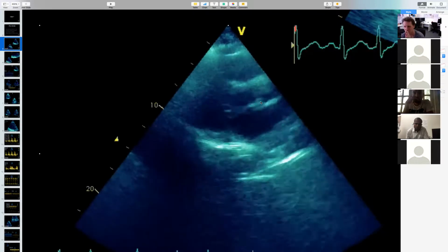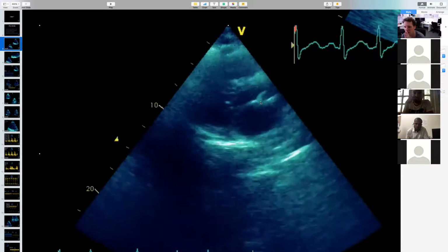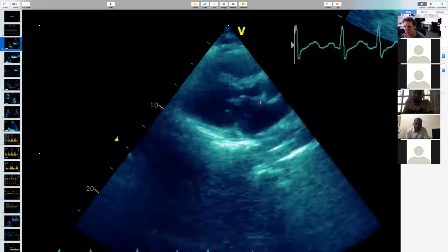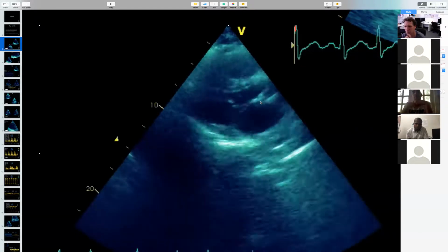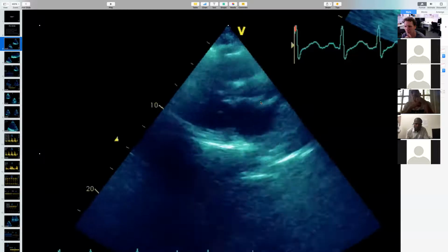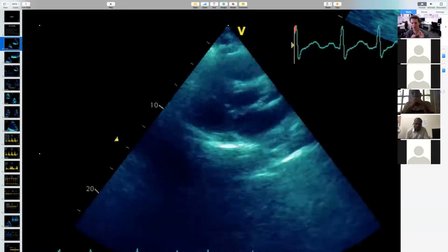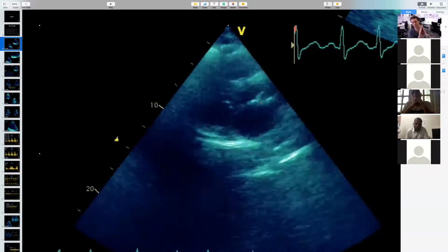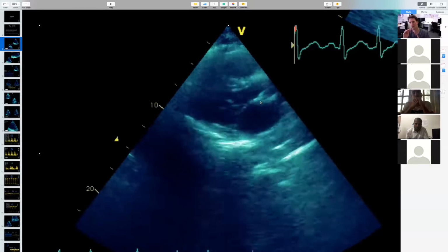Yeah. So anatomy and morphology of the valve. Nice. Valvular and subvalvular thickening, chordae thickening, doming of the anterior mitral leaflet at maximal opening. Beautiful. And then work it back, see the whole heart. So what else do we have? If you go for the mitral stenosis, LA enlargement. LA enlargement, yeah, and SEC.